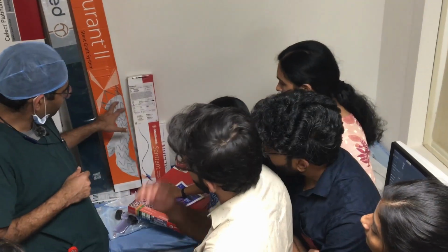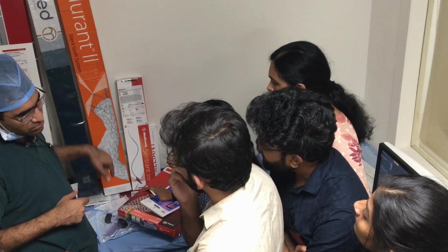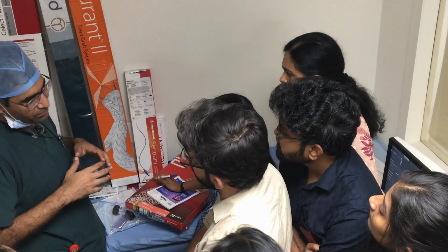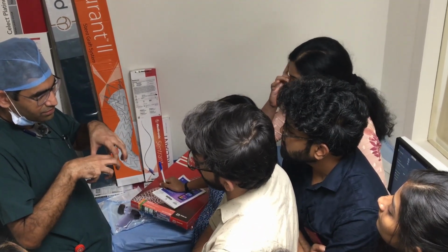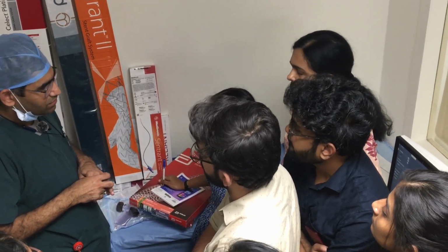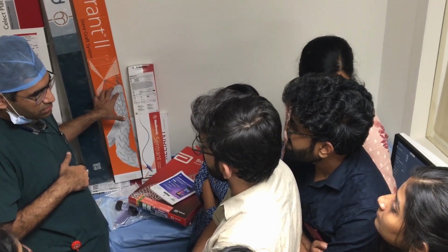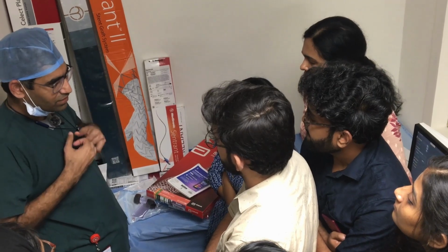Then they came with this fixation. It has barbs or hooks, so it goes in a healthy artery above the kidneys. So this is a suprarenal fixation device. The hooks will go above the kidneys into normal artery and anchor there, so device migration will be less. Not every stent, only some stents. This is designed for aneurysm. For aneurysms, you can use this where you want anchoring on top. These barbs will anchor and will not allow migration.